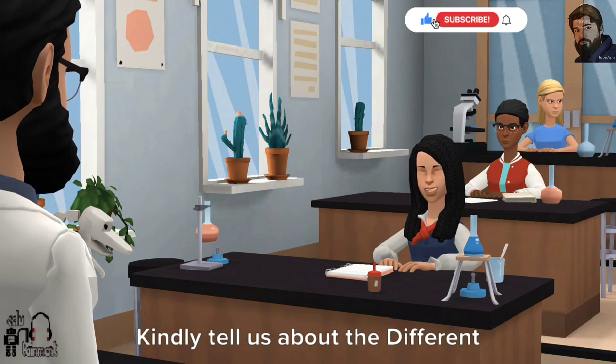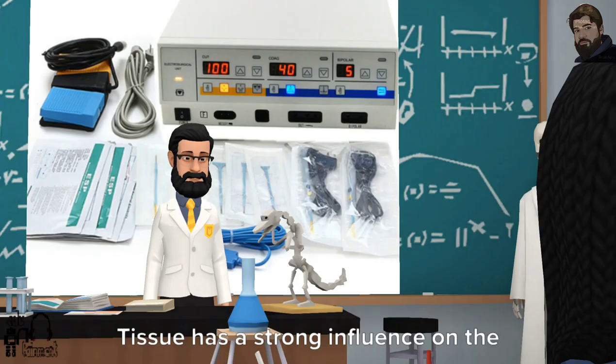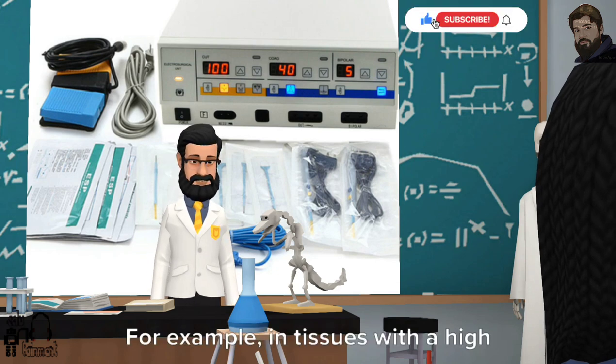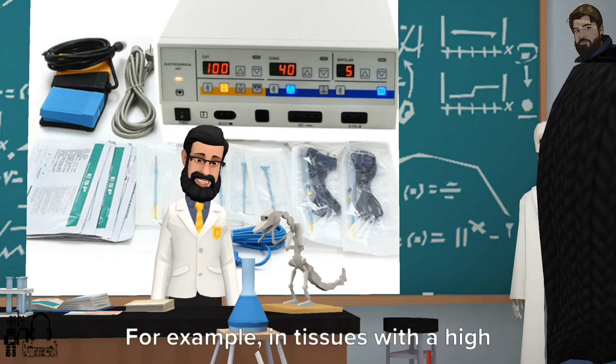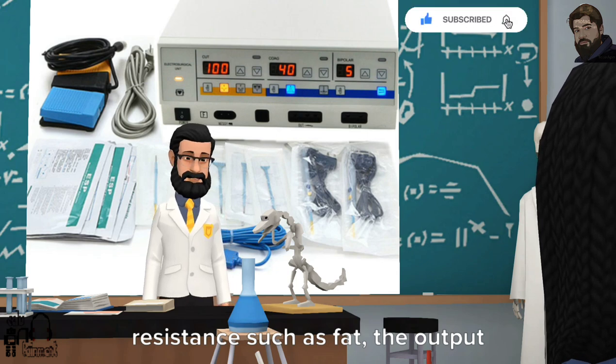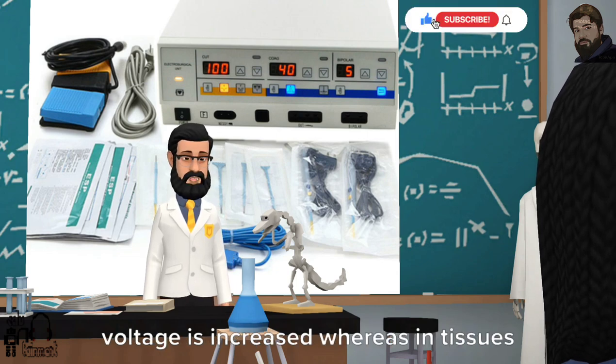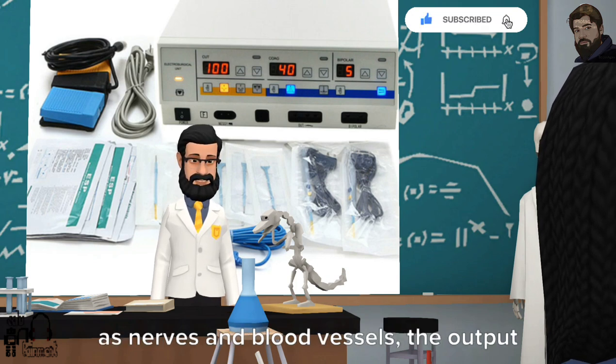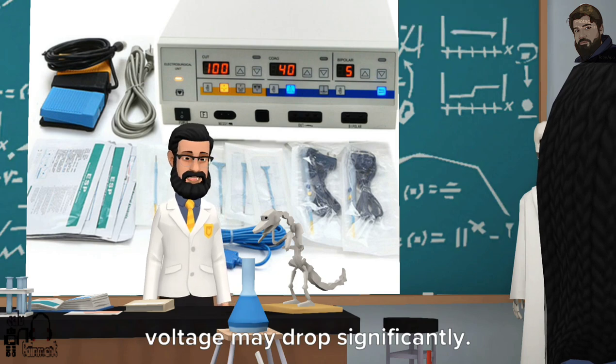Kindly tell us about the different tissue properties. Tissue has a strong influence on the quality of the cut. For example, in tissues with a high resistance such as fat, the output voltage is increased whereas in tissues with a low electric resistance such as nerves and blood vessels, the output voltage may drop significantly.